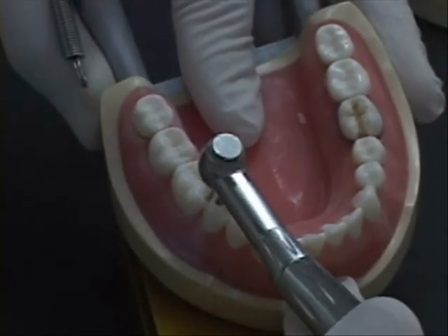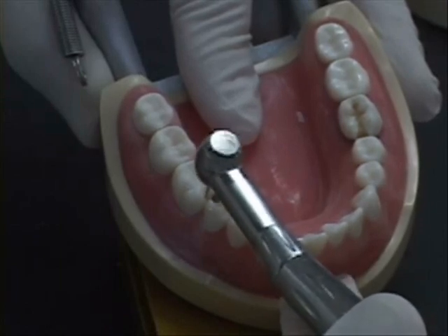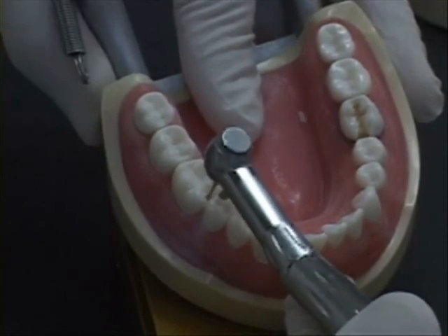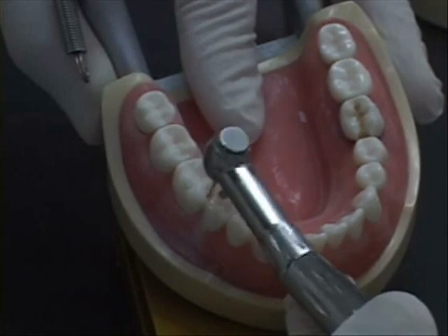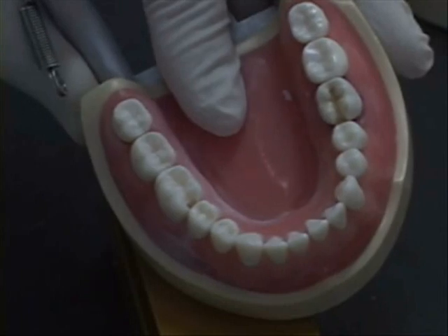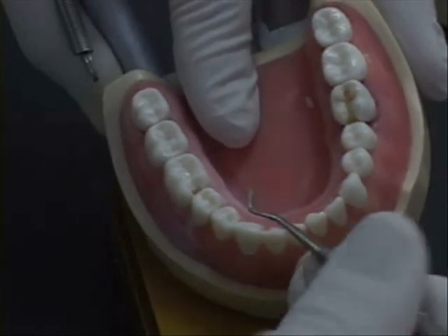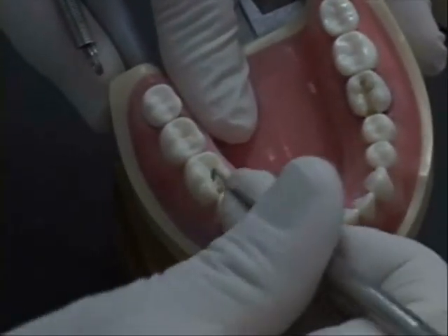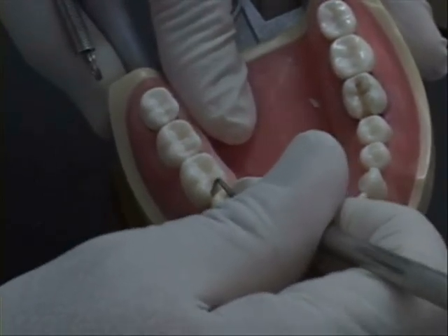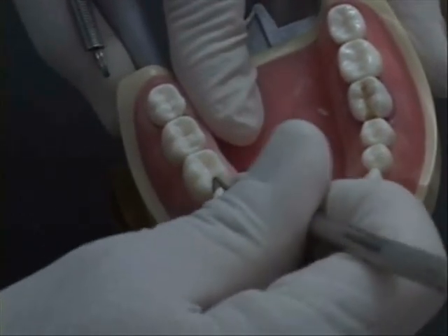So I put this down to the gingival floor, come facially and lift up. As I lift up, it removes some of the facial wall without hitting the adjacent tooth, and leaves a little sliver of enamel there that's undermined. As you can see, that little sliver right there. So the next thing I'll do now, I think my gingival floor is okay. So I get my hatchet, I lean this in, figure out my angle of departure, and just cut down with the hatchet without injuring the adjacent tooth.